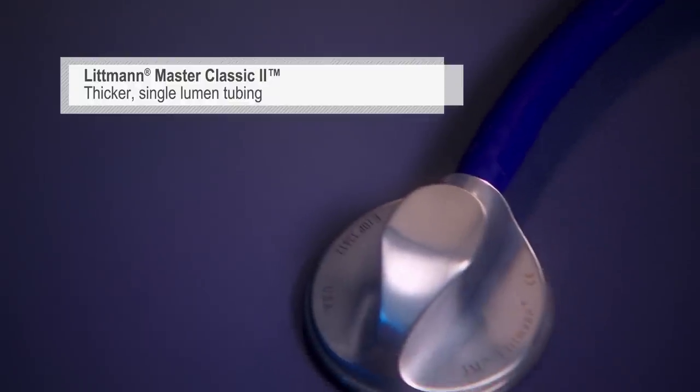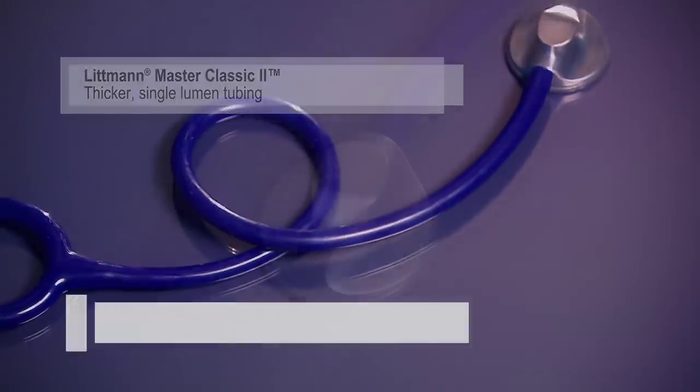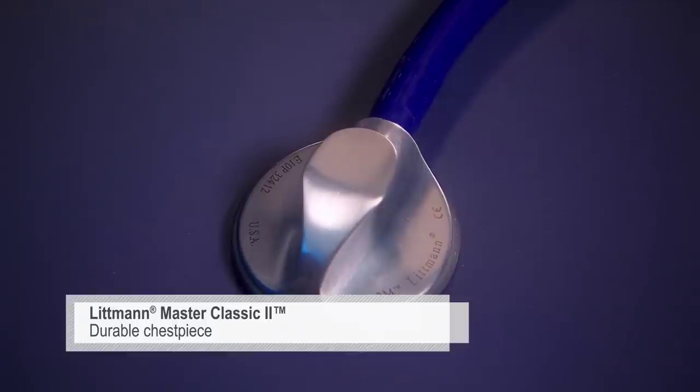The ergonomically designed single-sided Master Classic II features thicker, single-lumen tubing and an award-winning, durable chest piece made of high-density zinc alloy.